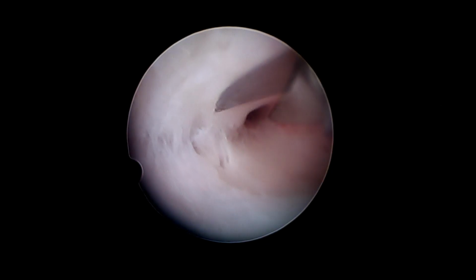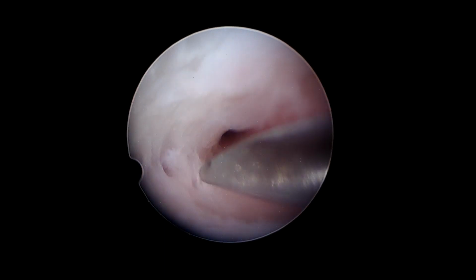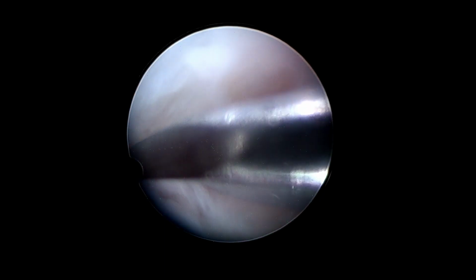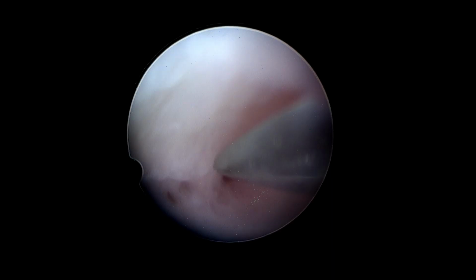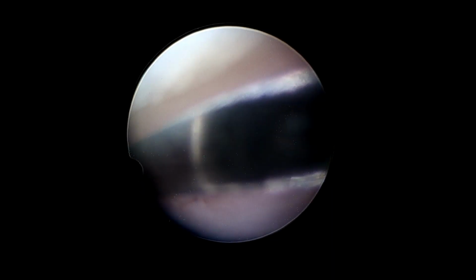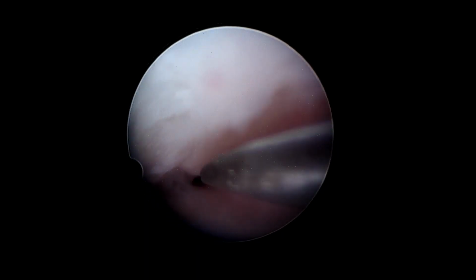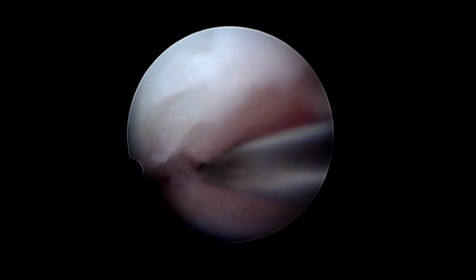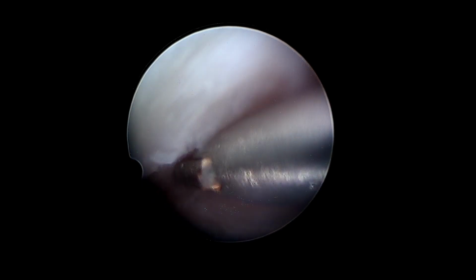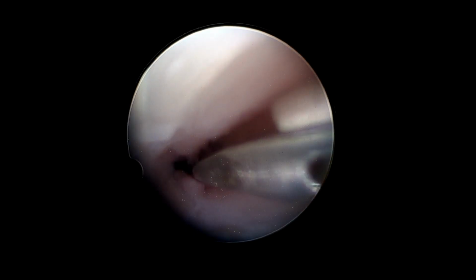If you go in the wrong direction, there is a possibility you might enter into the subendometrial space and you will completely lose the uterine cavity forever. So once you identify the uterine cavity with the probe test, you try and cut the adhesions. Those are these white colored fibers standing right in front of us, to be cut in a layer wise fashion.